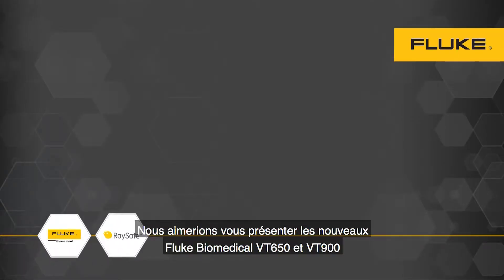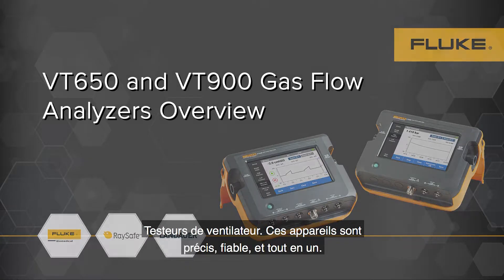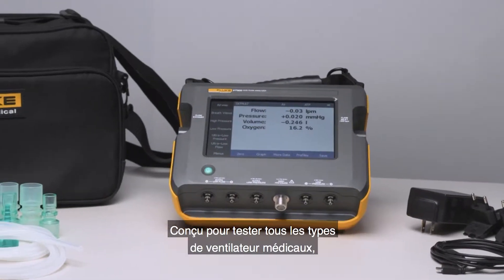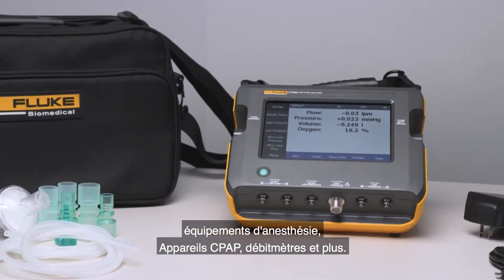We'd like to introduce you to the new Fluke Biomedical VT650 and VT900 gas flow analyzers. These devices are accurate, reliable, and all-in-one, built for testing medical respiratory equipment, including all types of ventilators, anesthesia machines, CPAP machines, flow meters, and more.